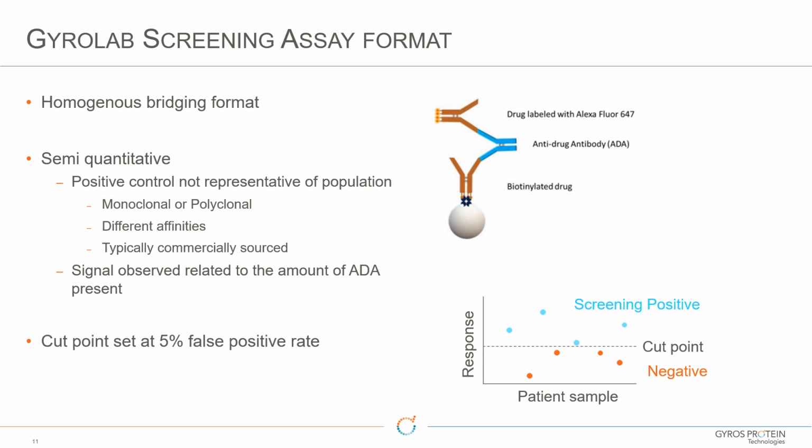Yeah, and when you change your positive control, even when it's the same rabbit, if you do a rebleed or a redose and take a new bleed of that animal, that response can be different. So I guess that's one of the reasons why you might use a monoclonal to scale your assay, to make sure that your reagents are performing the same every time. It may not be relevant from a population standpoint, but what it can do is tell you whether your assay is still performing year in and year out the way it was.